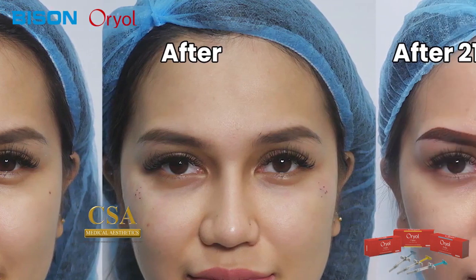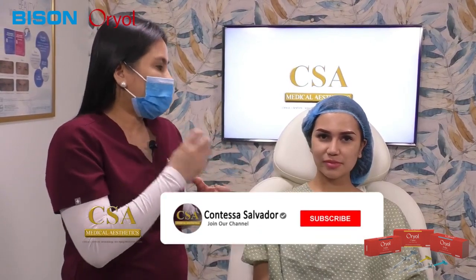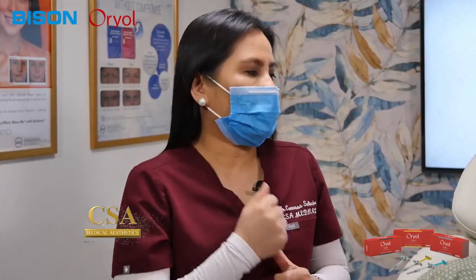Plus, there's a smoothness in the junction between the lower eyelid plus the upper cheek. So we were able to correct volume loss, also the darkening under the eye, and also the skin elasticity. Okay. So, all of the above, right? And the thing with that, the PDO threads will still synthesize new collagen, elastin, and other skin tissue network.